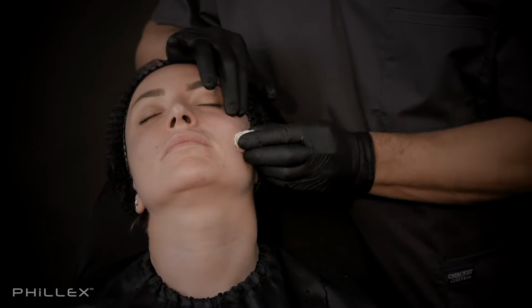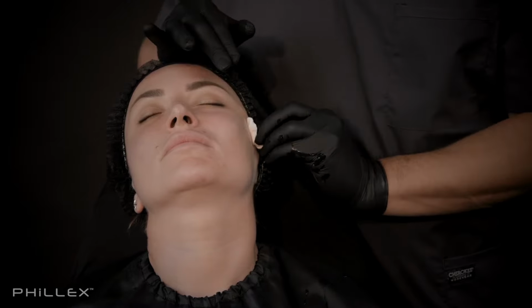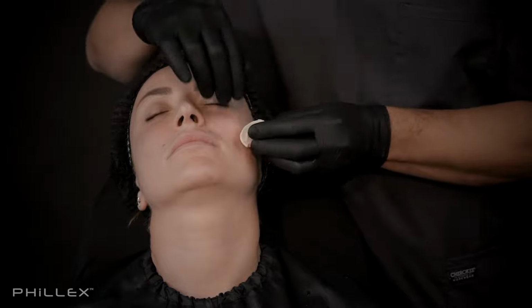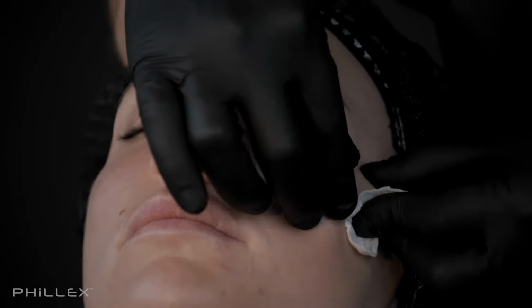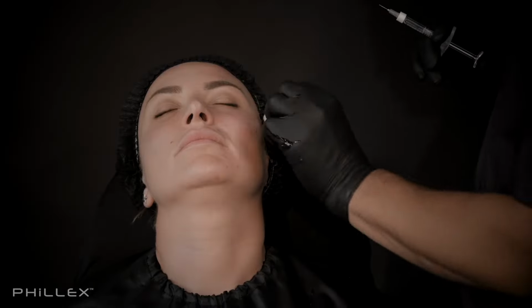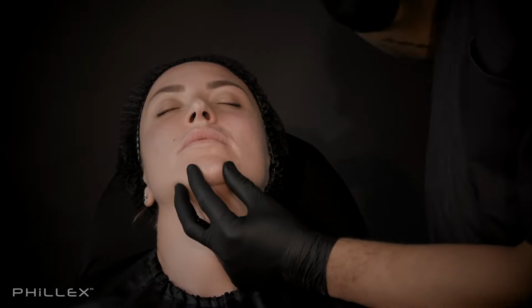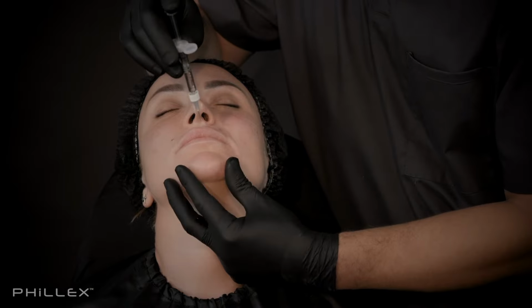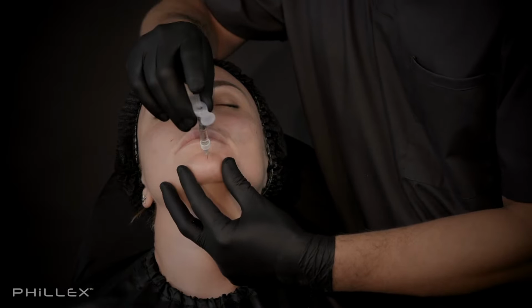What you can see is that this technique is good enough because we have no hematomas and there is no bleeding, and the only thing that we have to do is light massage and contouring to create the final result as we want. Well, next injection is the light changing of the form of the chin.